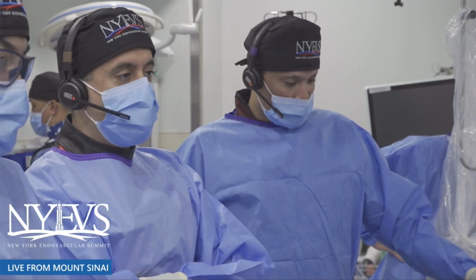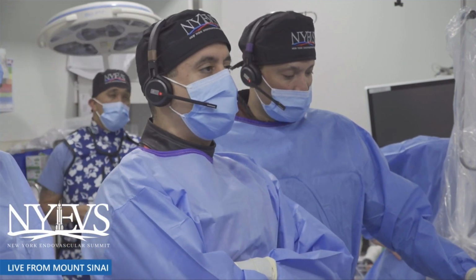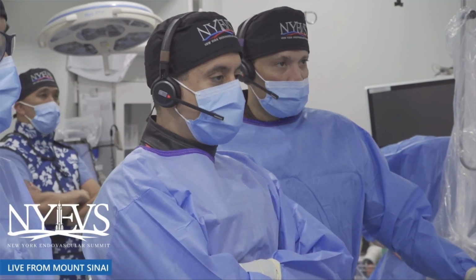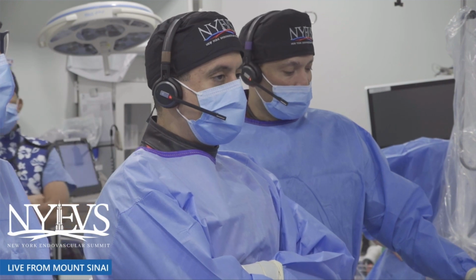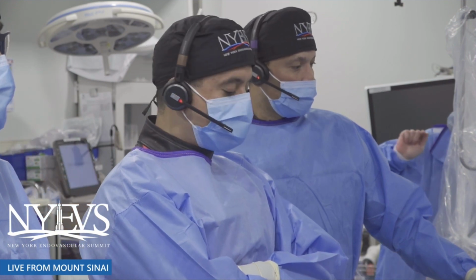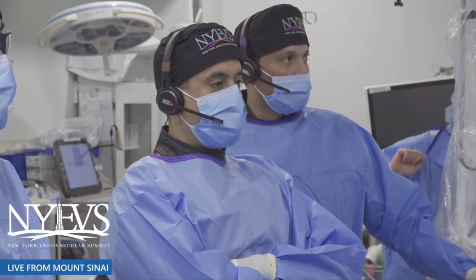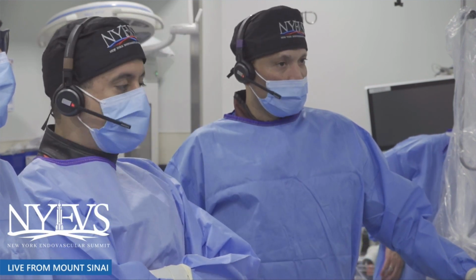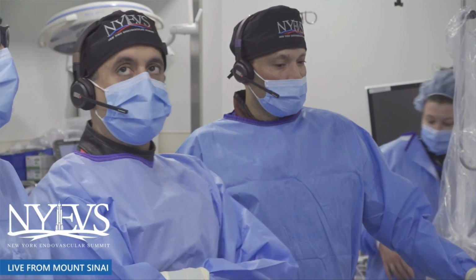I would say with that appearance, I don't think shockwave's that effective just because it's eccentric and it's bulky calcium. I agree with you if it's circumferentially calcified, lead pipe type vessels that you're not going to be able to open up with stents, there's a role for shockwave, but I wouldn't use it here. I'd save the money on the shockwave and put the two covered stents in and kiss them at the bifurcation.